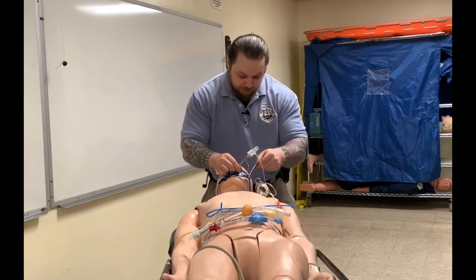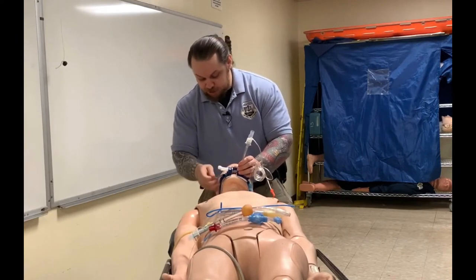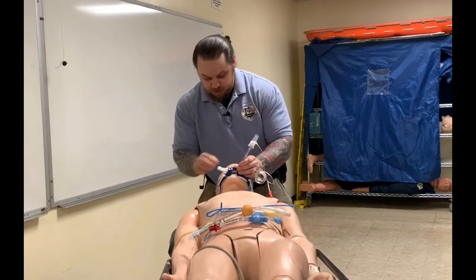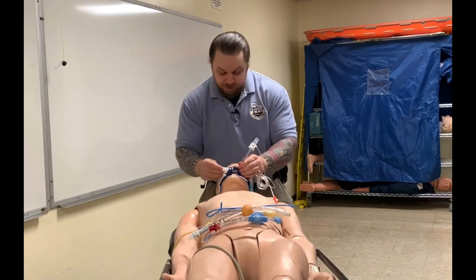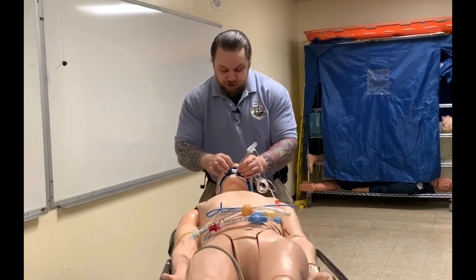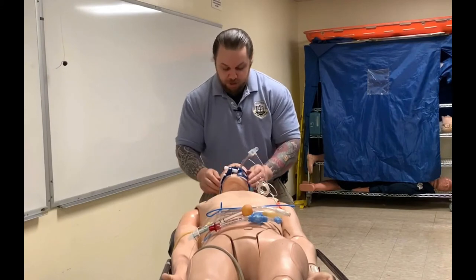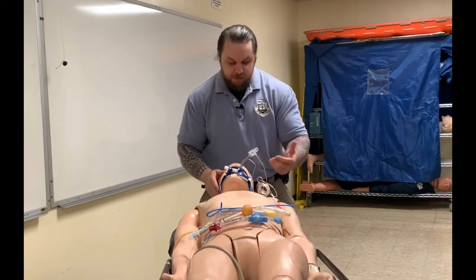Once I've used the slider clamp, I don't need it anymore, so I'll remove it and secure my tube. Notice I do not yet engage my screw clamp — I want to adjust my velcro so it's tightly snug on the patient first. Then I'll go ahead and secure my screw clamp, using just enough pressure so it's in place but not so much that I'm kinking the endotracheal tube.